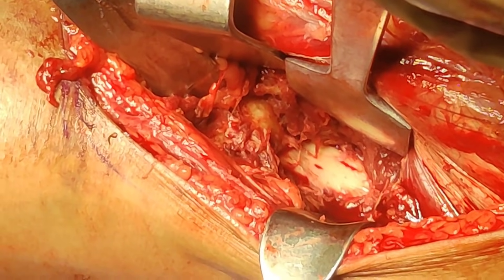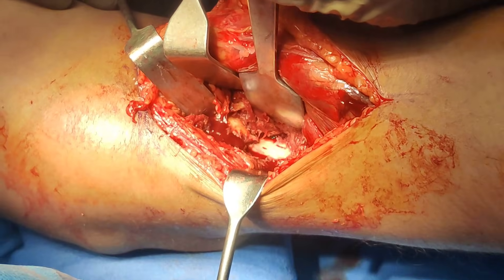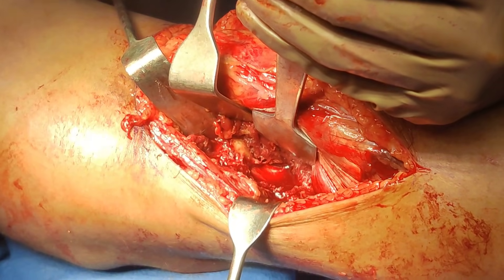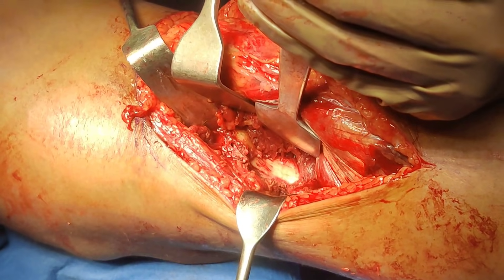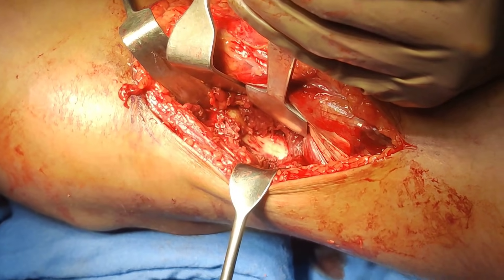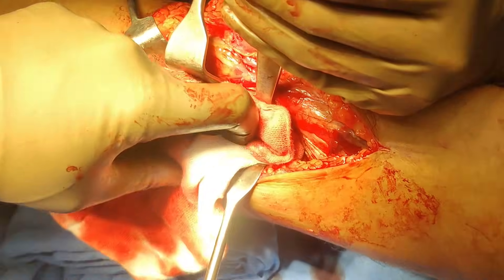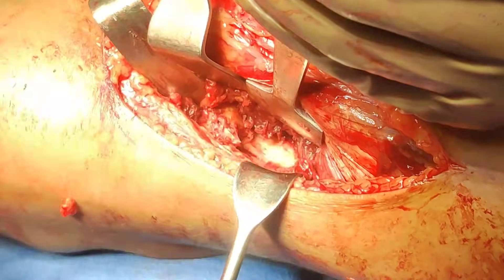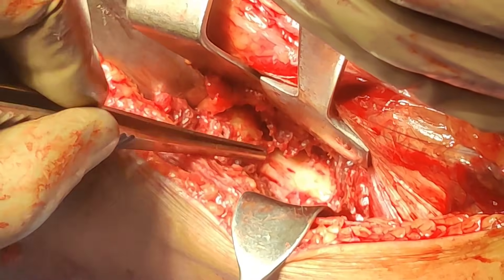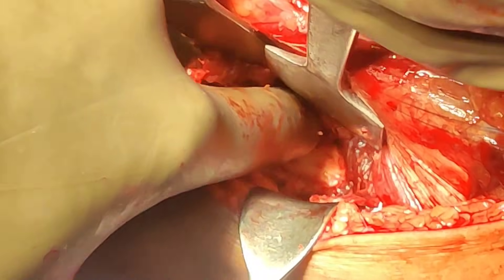In order to reduce this fracture: when you flex the knee it will relax and there will be shortening, but if you extend it that shortening will disappear and the fracture fragment will fall back in its position. We have put a bolster just underneath the knee — this creates extension so the leg is hanging in the air, and once we do that the fragment is beautifully fallen back in place. Your shortening and fracture fragment — the apex, what we call the wedge — is just here. Now we have got full access here.